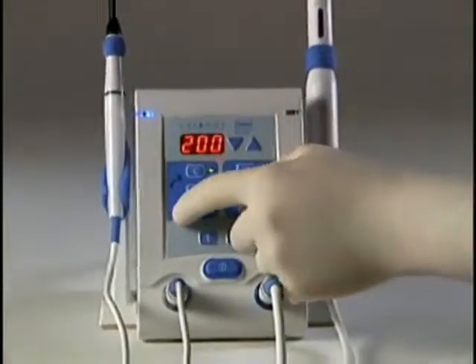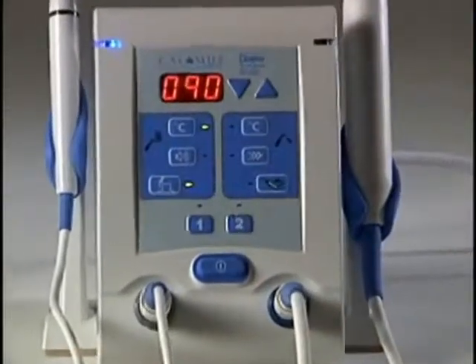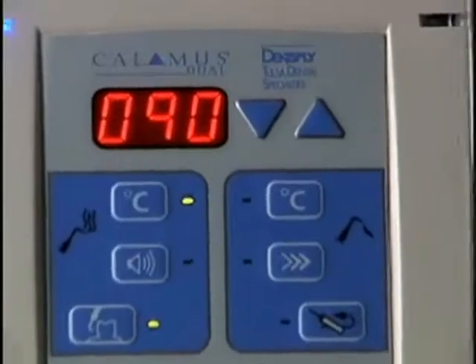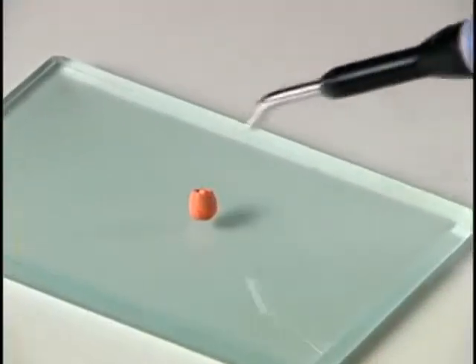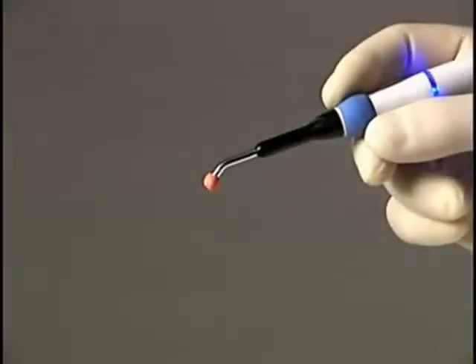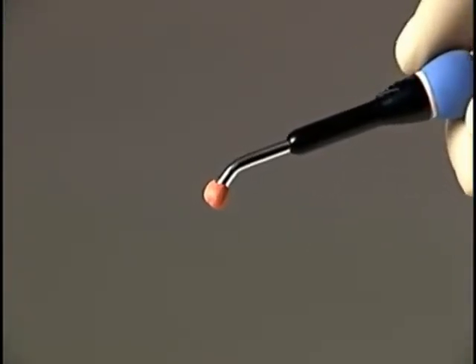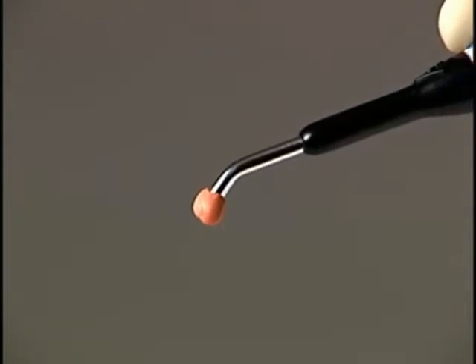Always press the TR button to set the temperature to 90 degrees C before starting the pulp sensitivity test. Place gutta-percha on the tip of the thermal response tip before applying the tip to the patient's tooth. Do not place the tip directly on the tooth.